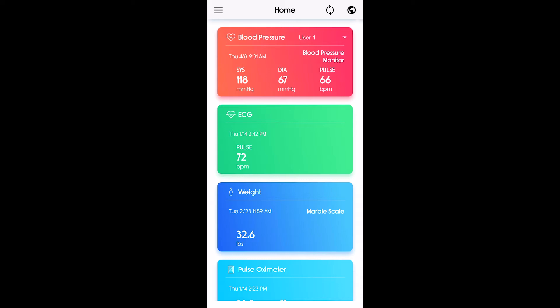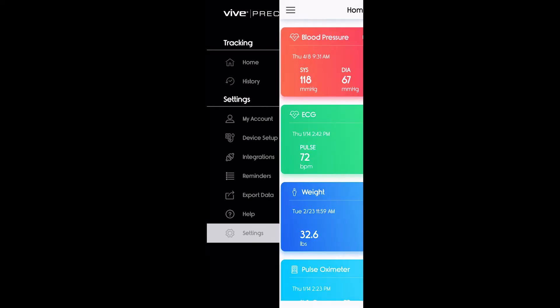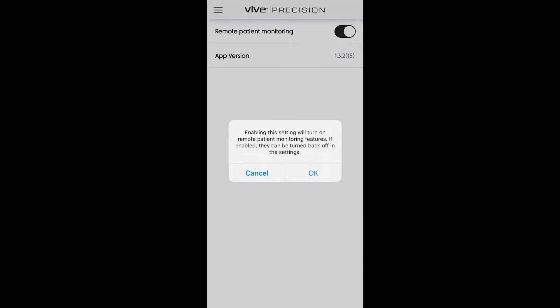Go ahead and click the menu button in the top left corner of the home screen, then go down to settings at the bottom of the menu. Then click the toggle switch for remote patient monitoring and then click OK.